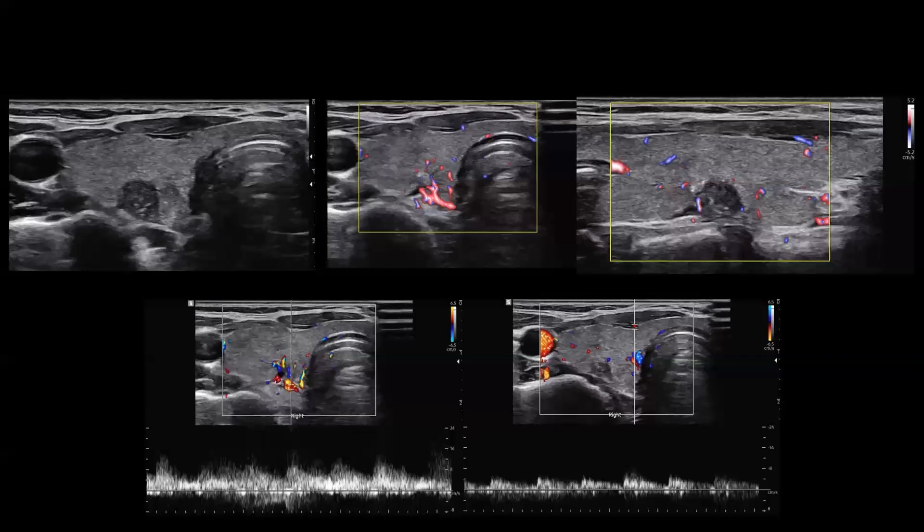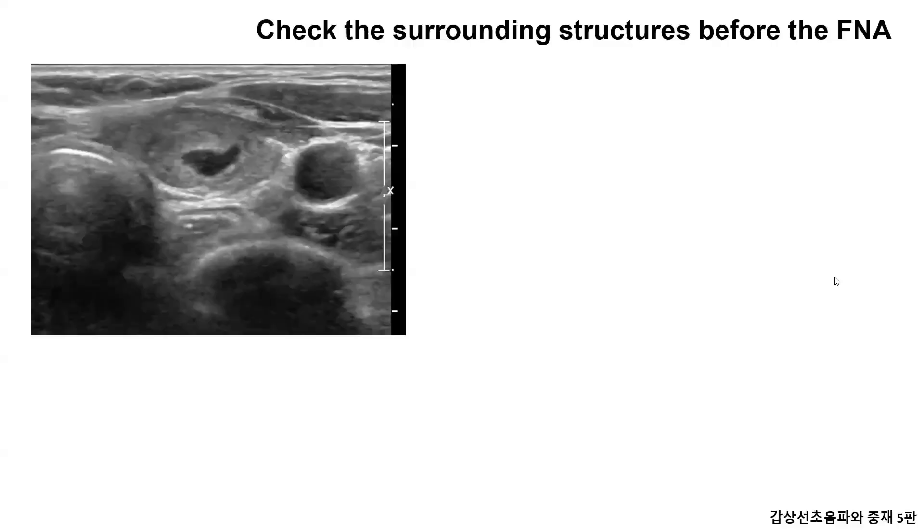This patient has an 8 mm suspicious nodule on the right thyroid. The superior thyroidal artery is seen in the front of the thyroid gland. Vascularity in the superior part of the nodule is prominent, so you should avoid poking it. Doppler is available for artery verification. There's an esophagus behind this nodule, so the examiner needs to be careful not to let the needle advance backward.